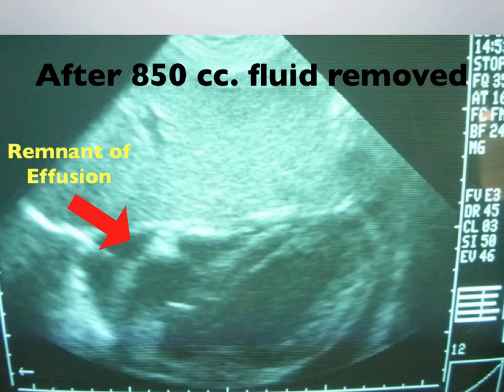This is the ultrasound after the fluid was removed, and you can see over here that there's just a remnant of the effusion remaining, and 850 cc's were removed. The patient's symptoms immediately went away. Now, normally I would not recommend tapping this patient dry. This patient is relatively dry here.